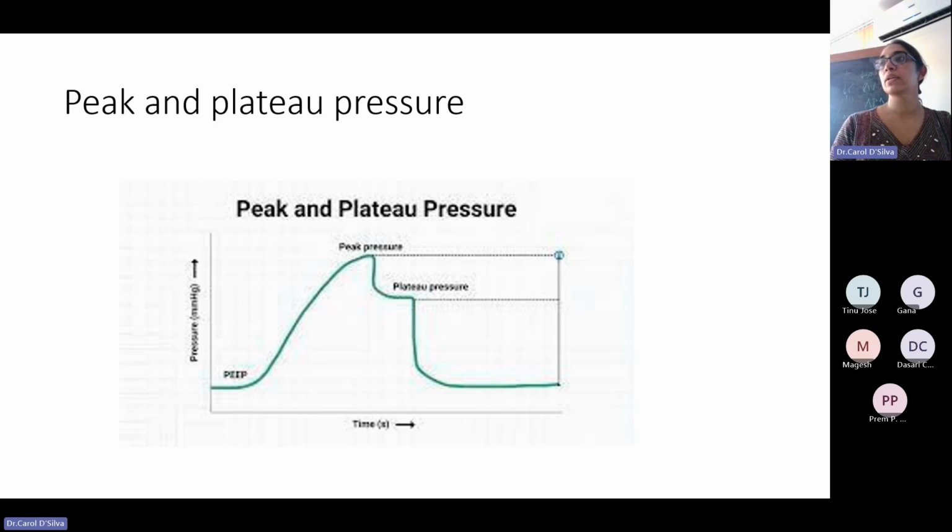By this, I'm telling the ventilator to stop all flow and not give any more flow to the alveolus. The pressure will immediately drop and become static, or start to get static. This plateau pressure should tell you exactly what is going on in the alveolus, because at that point of time, there is no gas flow. Correct.